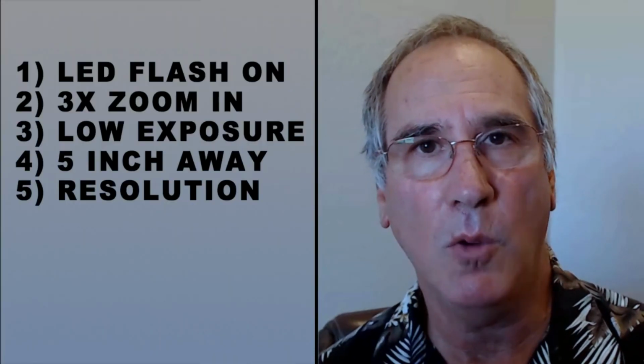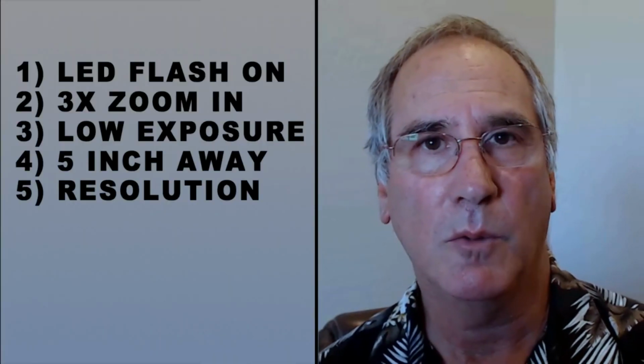Now, when you're all done taking pictures, many of you are emailing that to your dental lab. Choose the original resolution, not the lowest resolution, because when your lab gets it, if it's wide angle without a flash, and then on top of that, if it's low resolution, there's just no information there. Or if you keep the pictures and you crop it, you're going to see it's all blurry.